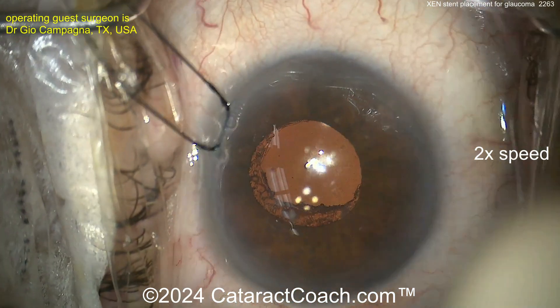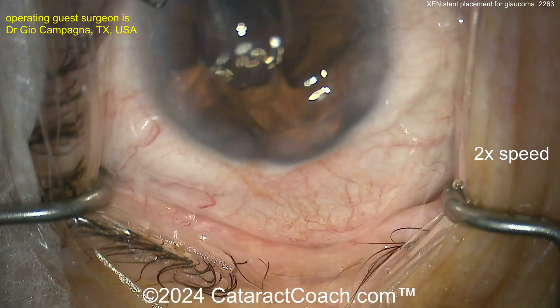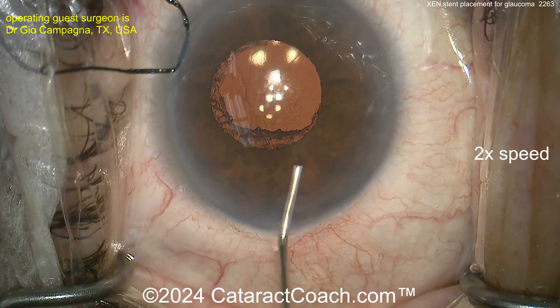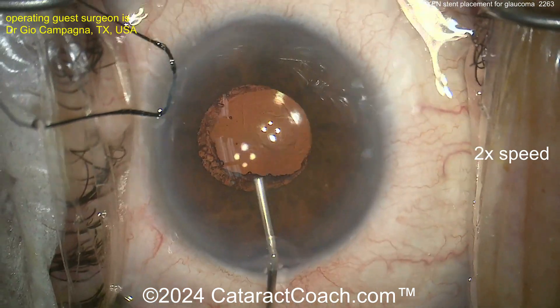Now let's take a look — it's already placed. Here's the mirror, and look carefully: there it is, just anterior to the trabecular meshwork. We've sped this video up to two times normal speed. Now you can wash out the viscoelastic using a cannula and BSS to irrigate it out.